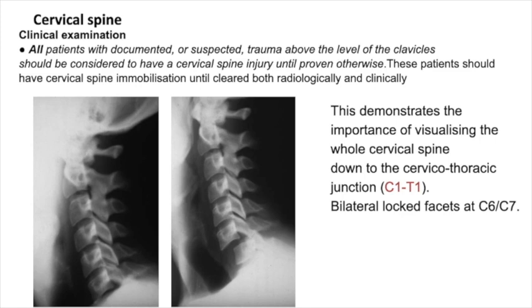So what happens sometimes when we receive this patient with an accident, maybe a road traffic accident or any kind of accident at the level of the cervical spine with damage at this level? It's very difficult to take the X-ray. It's very difficult because of the characteristics of the patient or the position of the patient.